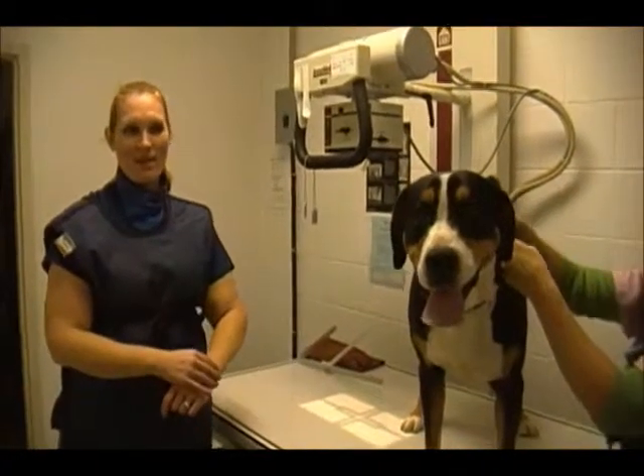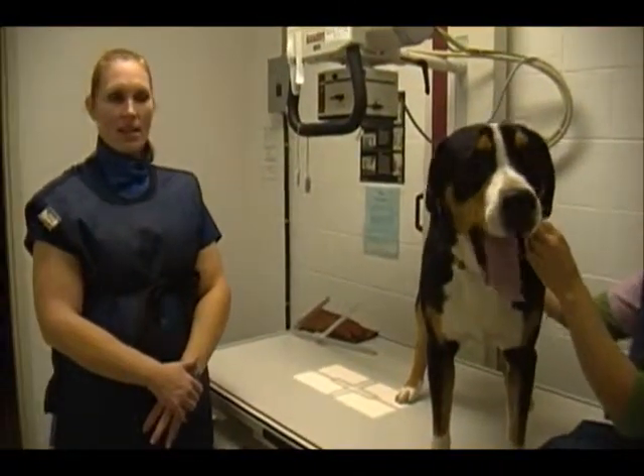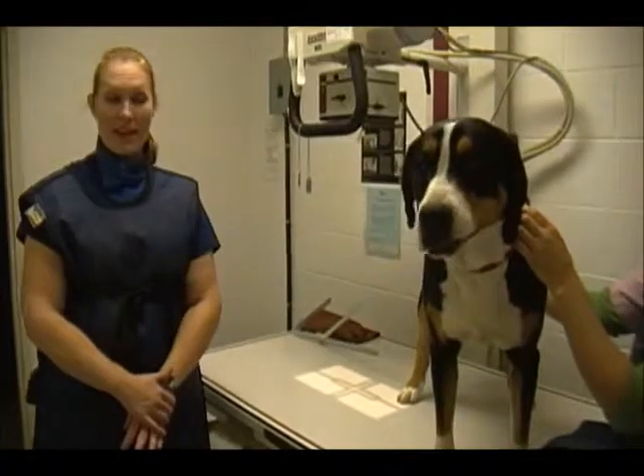Hi, this is Amanda Compton and this is my VET 122 video for proper positioning and evaluation of the pelvic region for OFA.